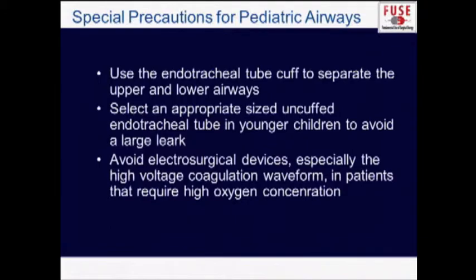Now, as talked about in an earlier talk, if someone has a comorbid cardiac or pulmonary condition where you really have to use a high concentration of oxygen, then you might want to avoid electrosurgical devices altogether, or at least the modulated and high voltage coagulation waveform, which is prone to sparking.